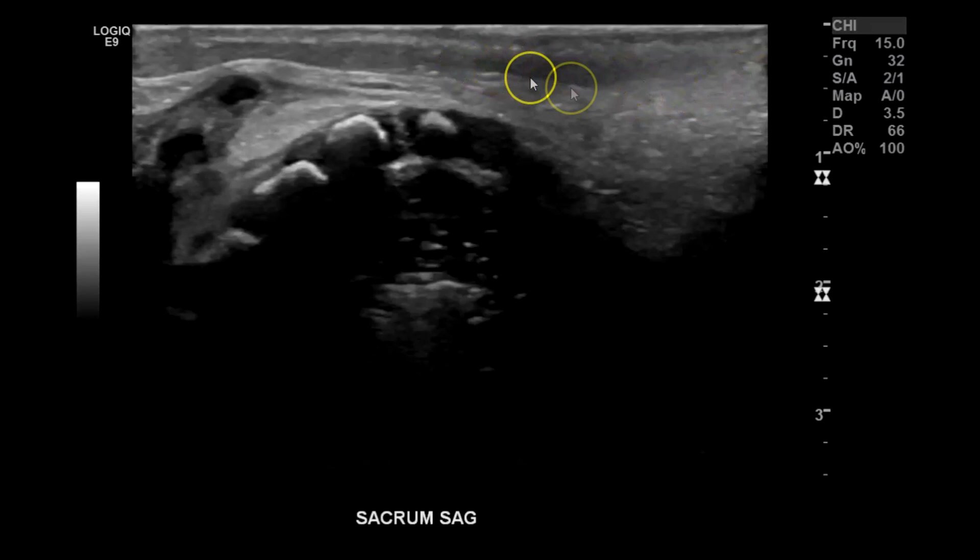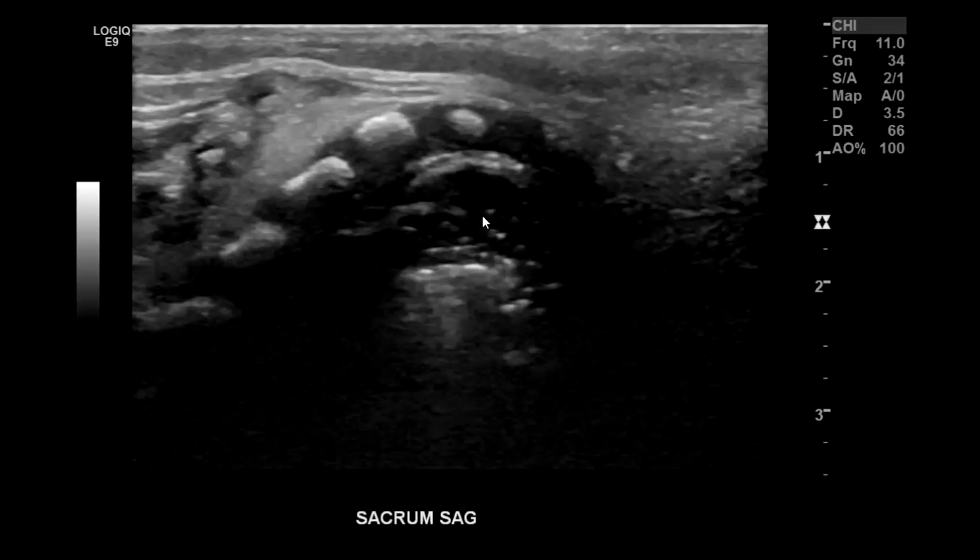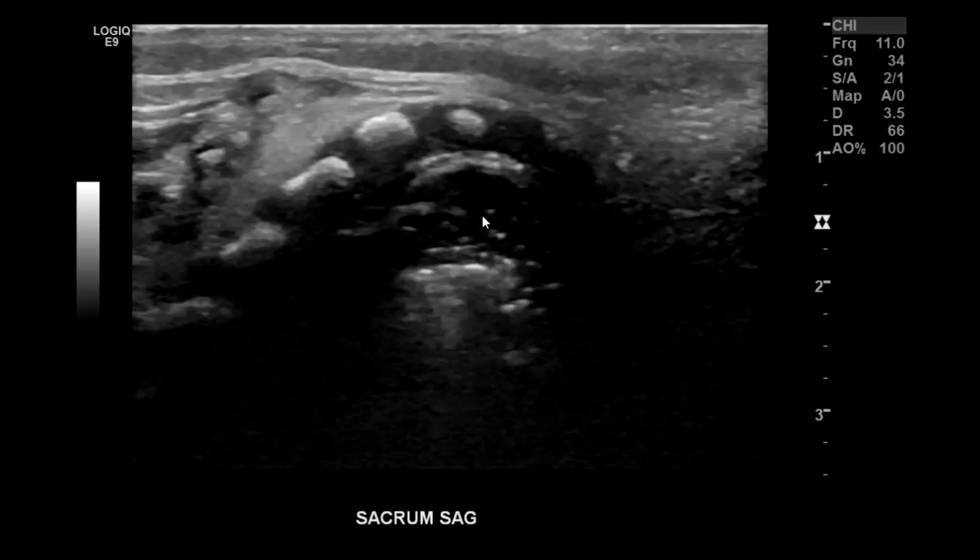This is the fifth sacral element here. You can see the skin — it's all intact. Usually around here you would find the coccyx; in older babies you'll see it a little better. I begin here and then start working my way up sagittally. Sacrum sagittal — take a few pictures and try to get all the sacral elements pretty clear.